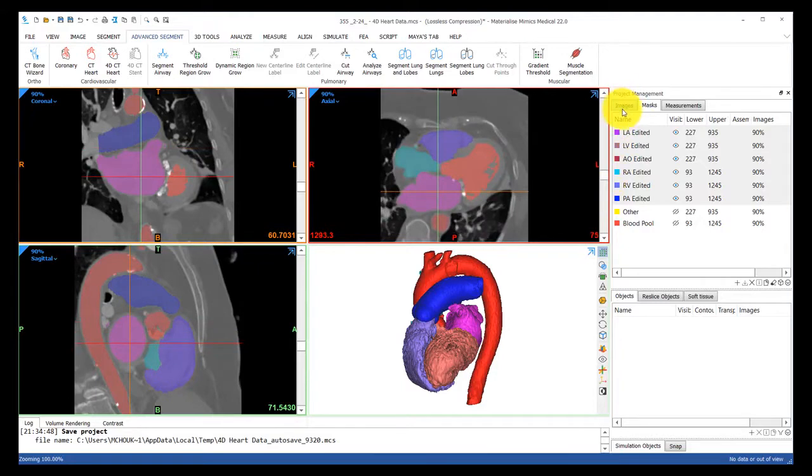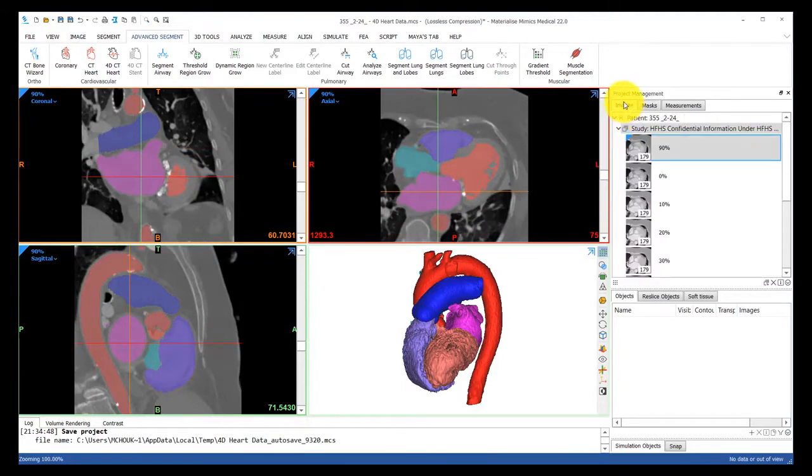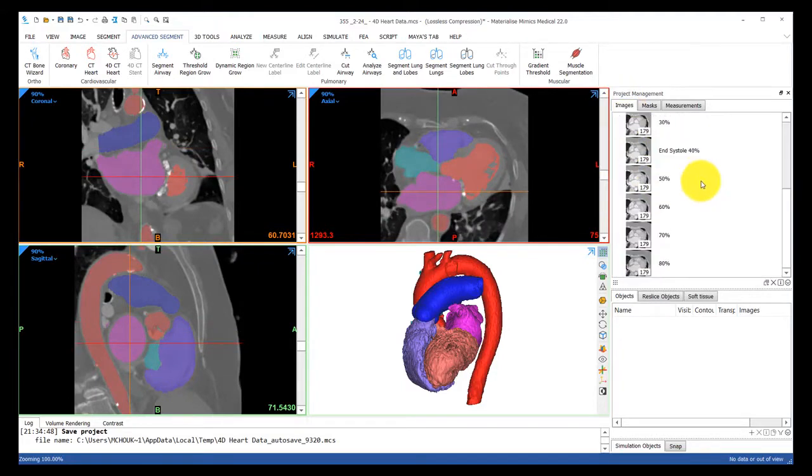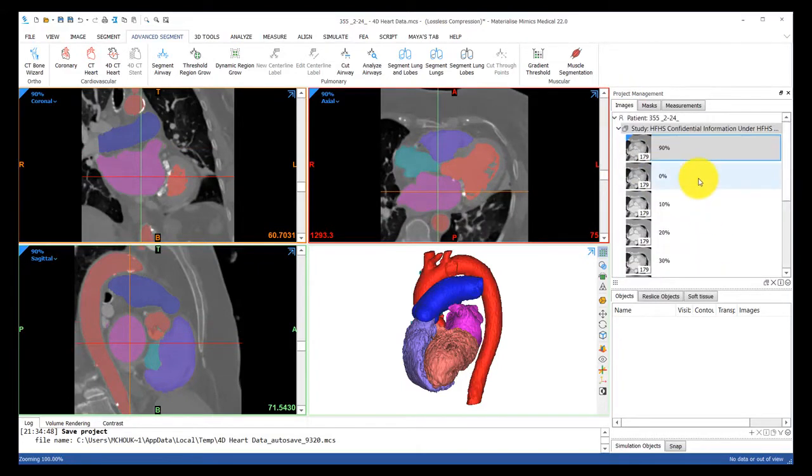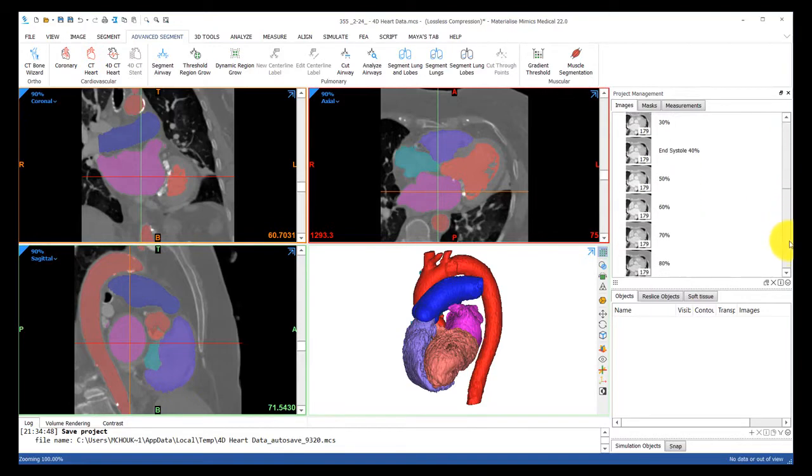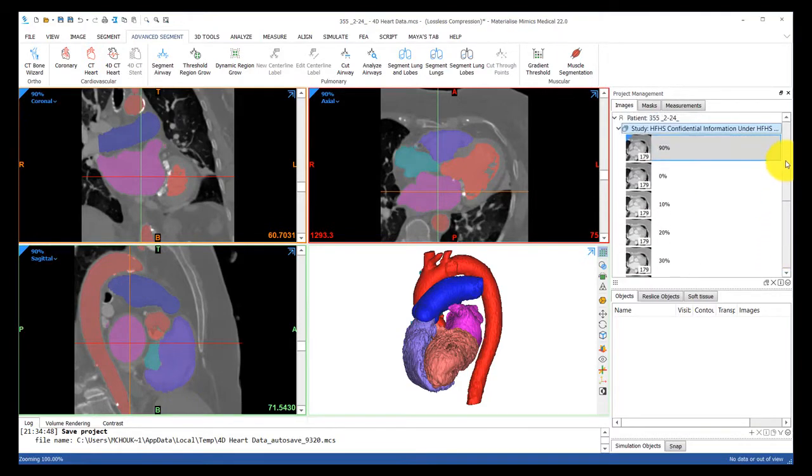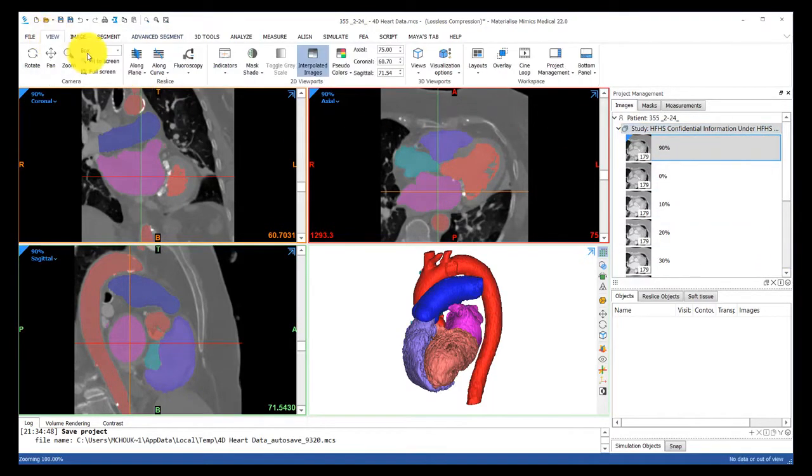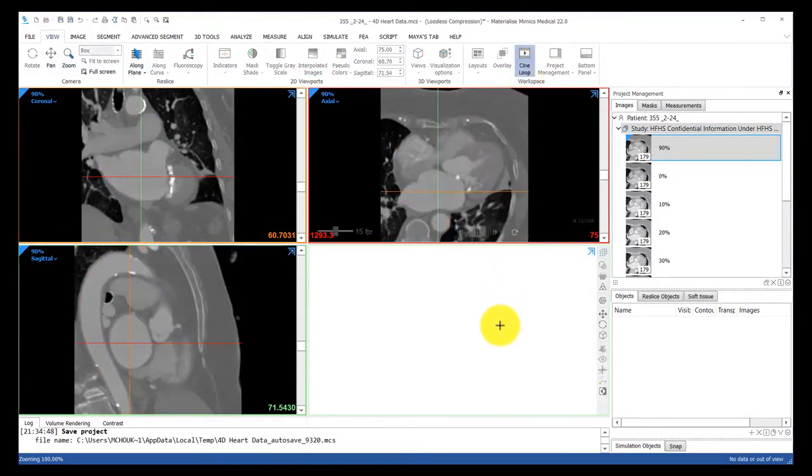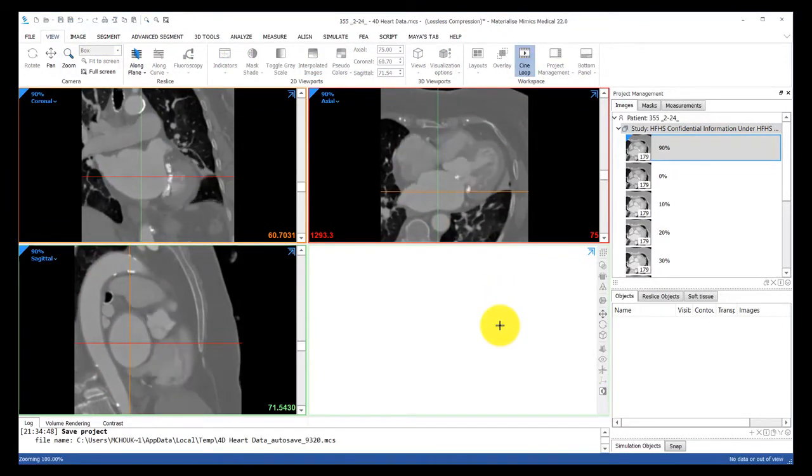Let me also show under the image tab how this project consists of phase data or multiple CT stacks of images taken at different times of the heart's beating cycle. We will later segment all these sets of images with one click.